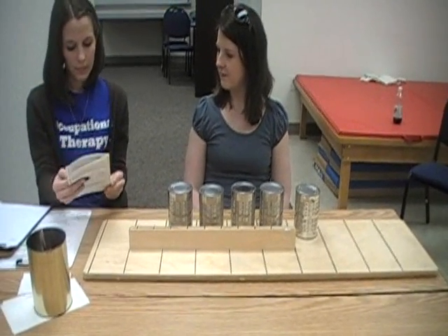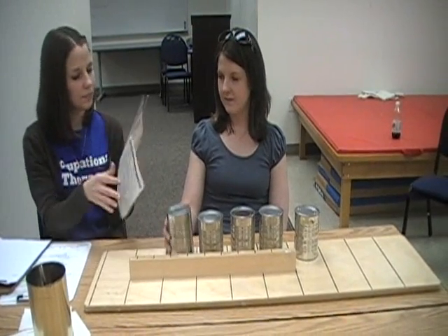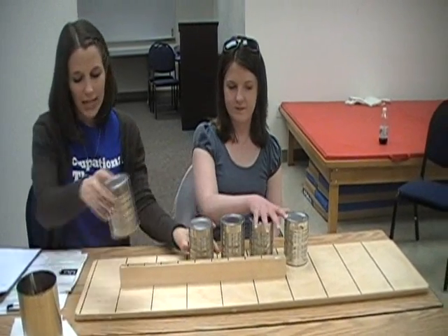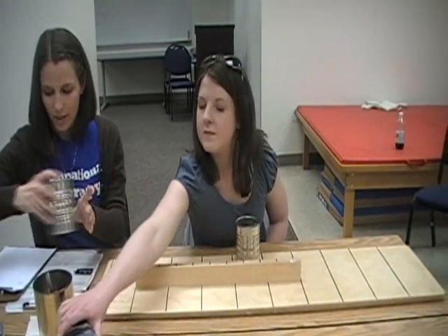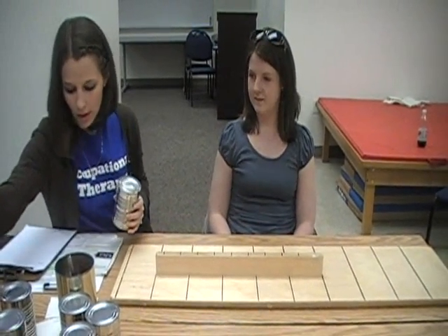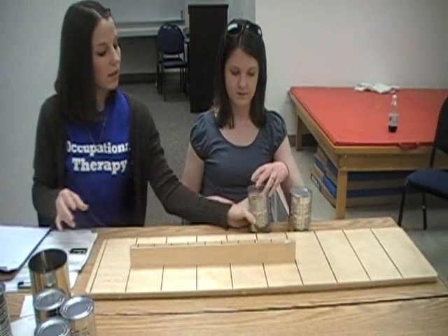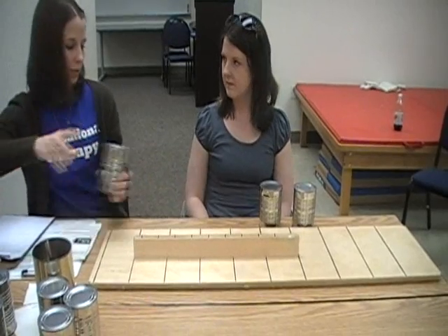And then you would do the exact same thing with the dominant hand. The last task is called lifting large heavy objects. You position the board in the same manner. This time you have cans that have liquid in them, which makes them a little heavier.